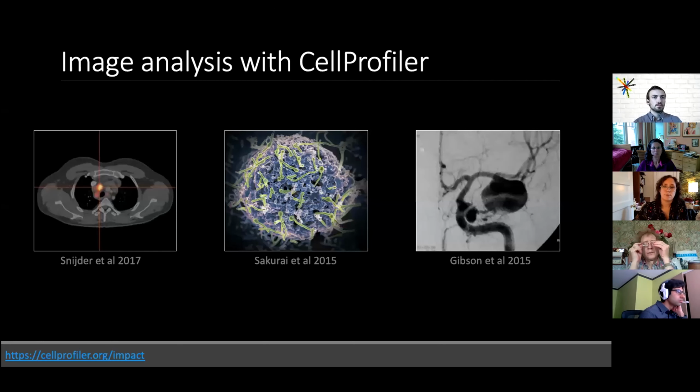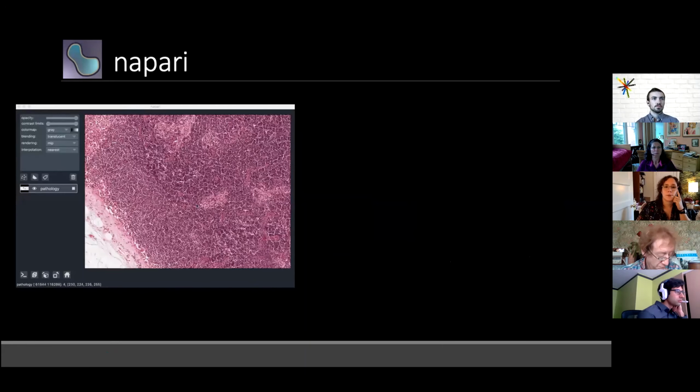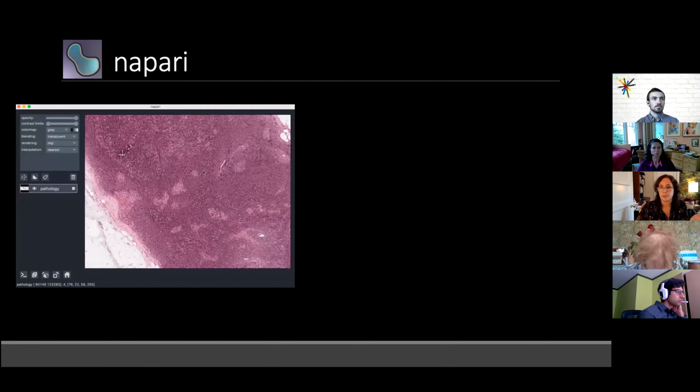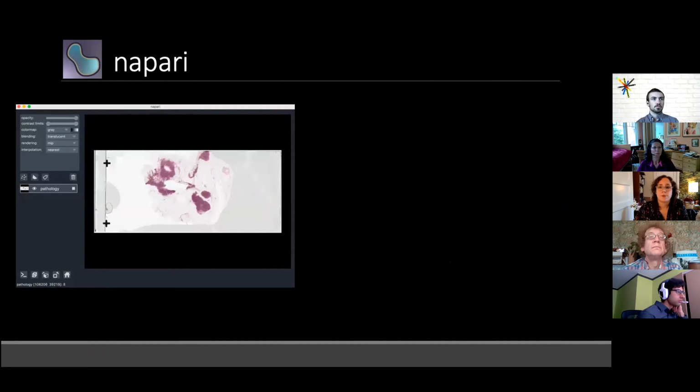And so finally, work from the Carpenter Lab has also been applied towards clinical trials for leukemia and lymphoma, identification of therapeutic targets to treat Ebola, as well as therapeutics to treat cerebral cavernous malformations, all based on this imaging data. And so another thing that I mentioned for clinical pathologists was the time constraint that is faced by clinicians, even after they might have gotten around the problem of digitizing their histopathological samples. And this is surrounding the use of hardware and software for navigating the digital images.